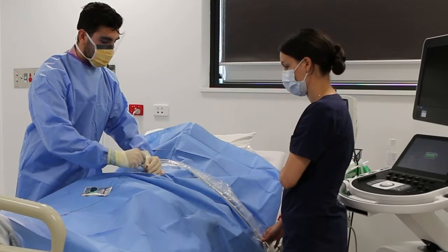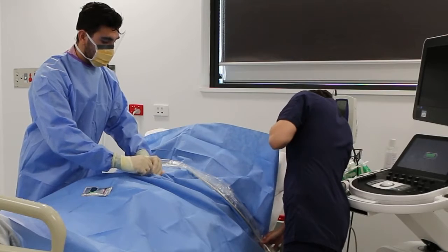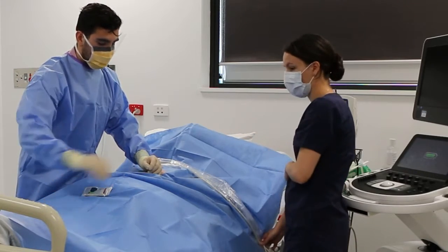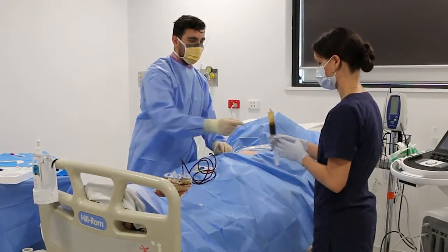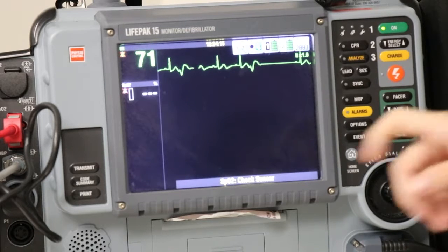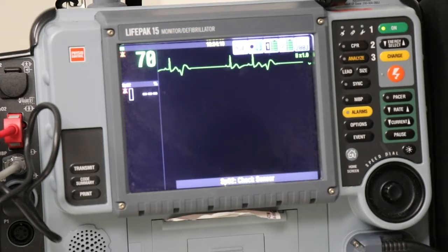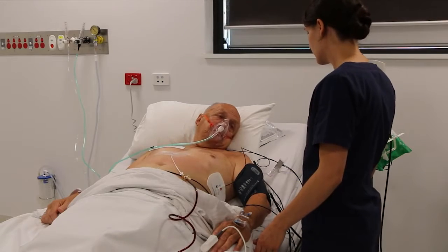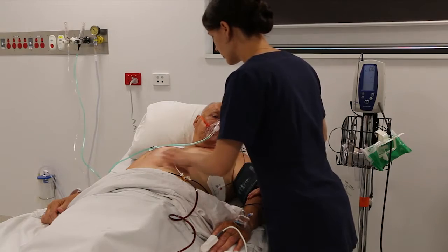During the procedure, the nurse's role is to assist the medical officer with the procedure and continuously monitor the patient throughout the procedure. Another nursing role is to collect specimens and attach the drain. Observe the patient's ST segments and patient's rhythm for alterations that may indicate myocardial damage or irritation by the needle, and monitor the patient for pain. Observe and record the drainage volume.